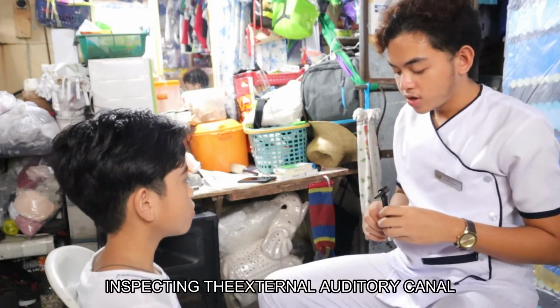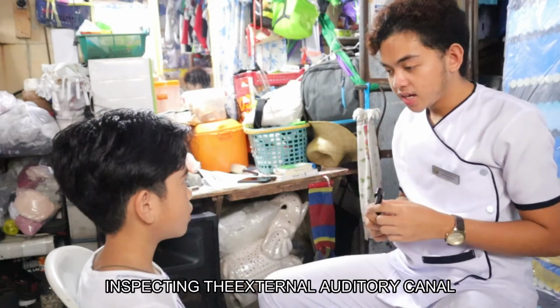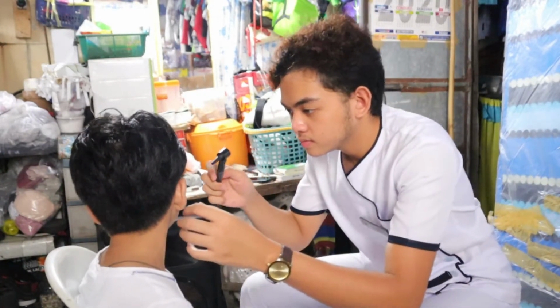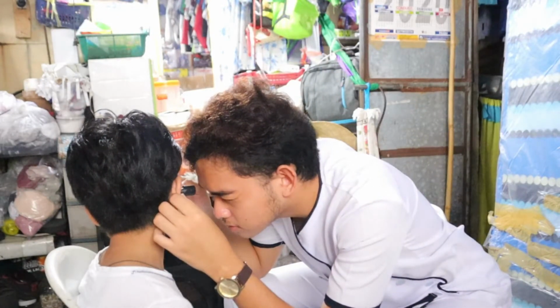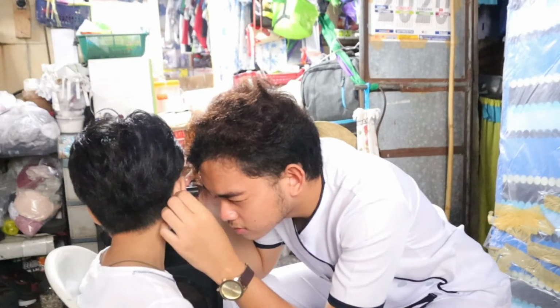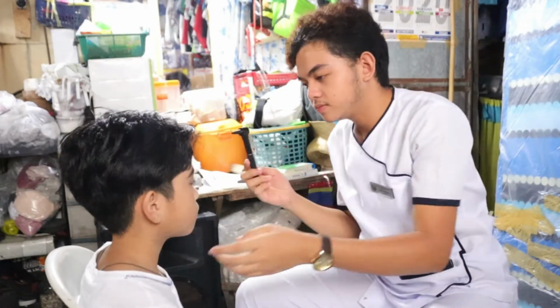Now, sir, I will be using an otoscope to inspect your external auditory canal for any color changes, any discharges, and nodules and cerumen. The other ear, sir.